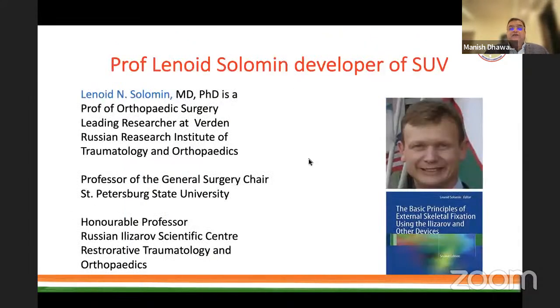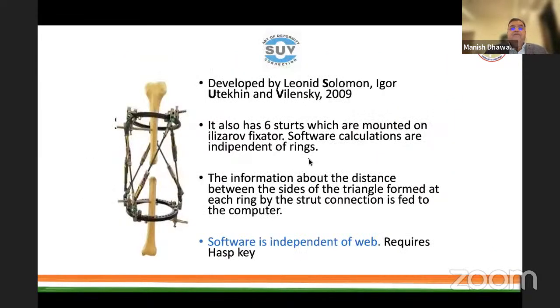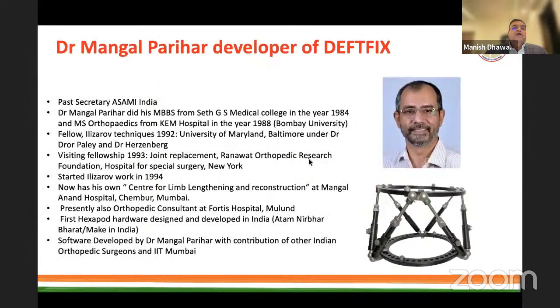SUV is the Russian hexapod, developed by Professor Leonid Solomon. Why is it SUV? Because it was developed by Solomon, Utykin, and Vilinsky. Leonid Solomon is the orthopedic surgeon, and Utykin and Vilinsky are the computer experts. This system is independent of the web. DefFix is our own Atmanirbhar Bharat, Make in India project.